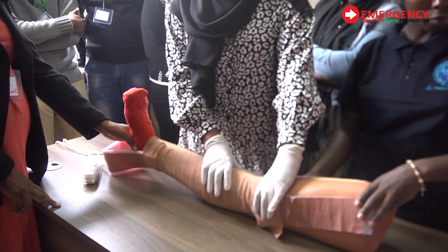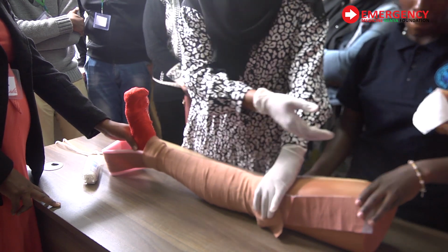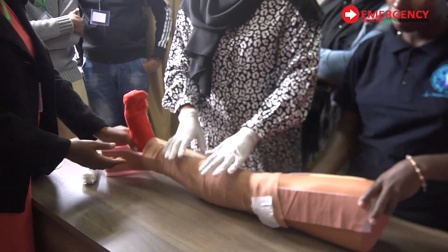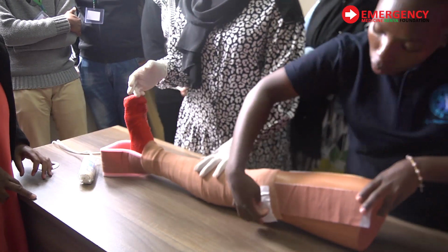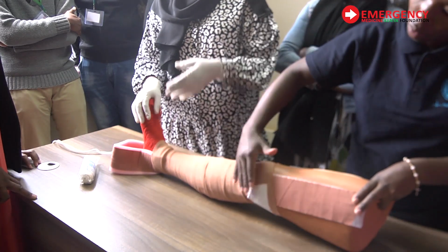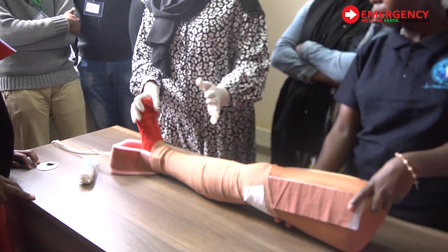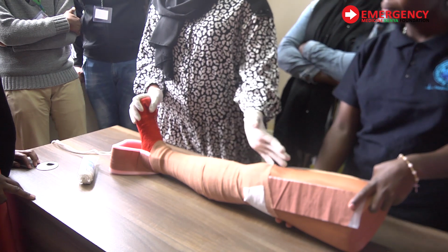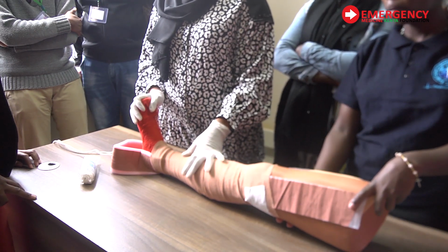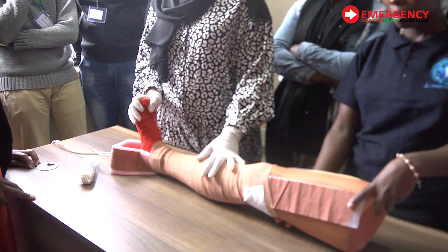So that's where now the other thing you need to be sure about. The Thomas splint, it's life-saving, yes. This patient can stay immobilized for almost a week as you wait for the orthopedic to come, for you to transport the patient, or however long our process takes. So he's going to be pain-free, he'll be able to sit up, eat his food. You don't want to be called every 5 minutes to give morphine and analgesia, okay? So you'll be giving him the regular medication, all right?